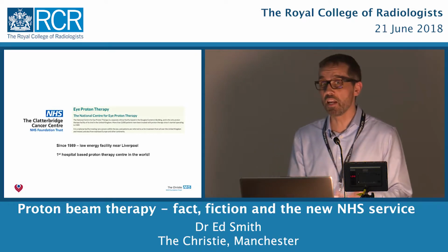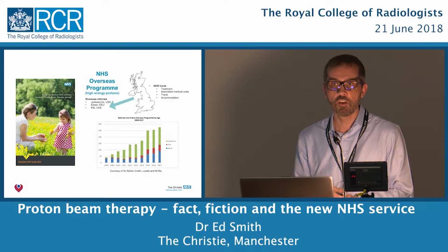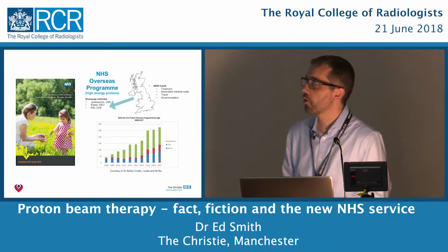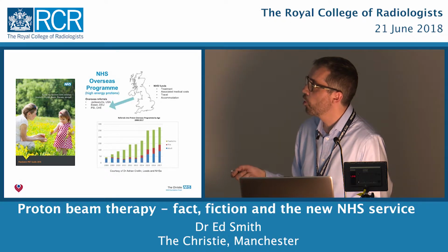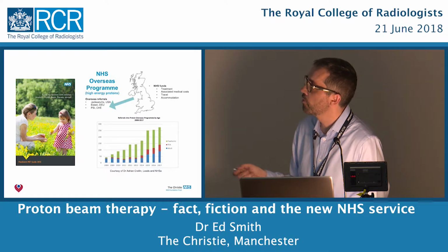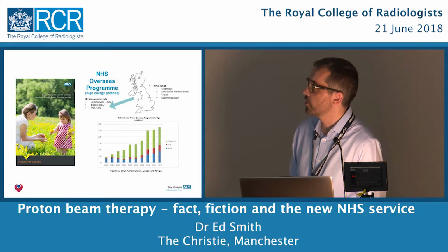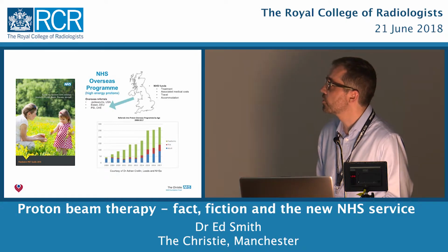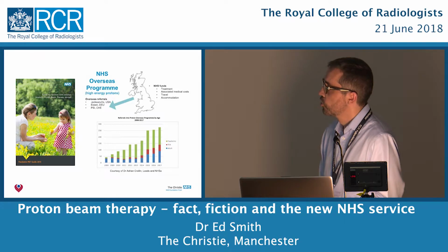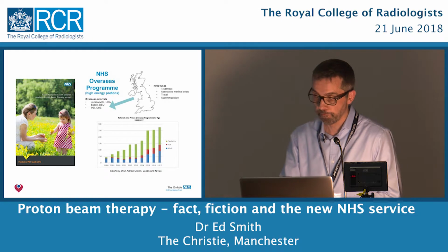What I'm focusing mainly on in my talk is high-energy proton therapies. And there's been a service there too. Patients have gone abroad for high-energy proton therapy since 2008. As you can see, the numbers have gone up and up and up over the years, and the current providers for that are Jacksonville in the United States, Essen in Germany, and the Paul Scherrer Institute in Switzerland. And the NHS funds treatment, associated medical costs, travel and accommodation. And it is a very successful service.